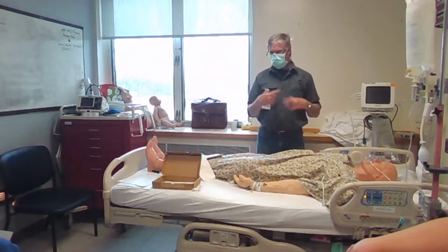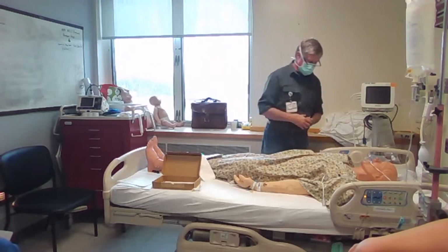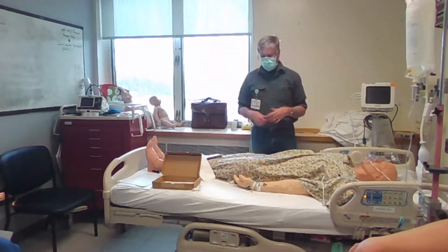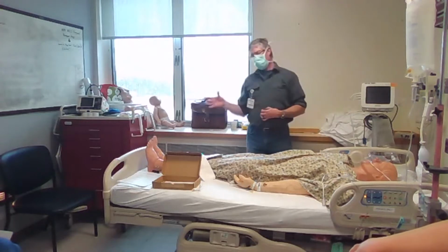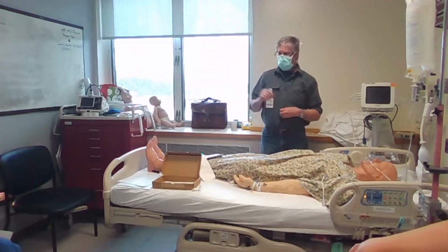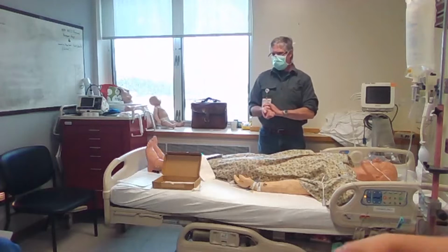Okay, next, we're going to go through the insertion now. I'll talk you through a few of the things and the different locations where we can put them in. Typically you're going to see an A-line in the radial artery. It can also be done in the ulnar artery, but one of the key things to remember is that the ulnar artery is actually 80% of the blood flow to your hand. So that's one of the reasons we choose the radial. The other reason is it's a lot easier to feel. Everybody knows how to find the radial artery?